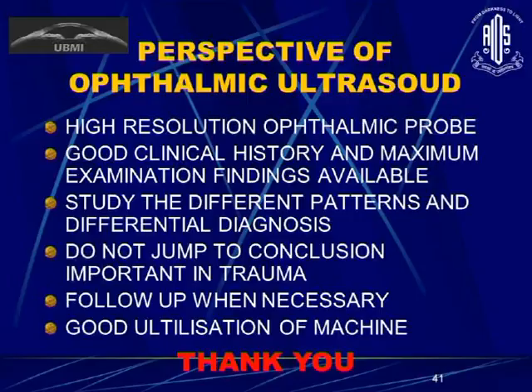And good utilization of the machine. There are lots of amplification factors. There are lots of gain settings in the machines. If you can just play around with them like a toy, how you do on a mobile phone, you can probably make a much better diagnosis and be much more helpful in the clinical picture.